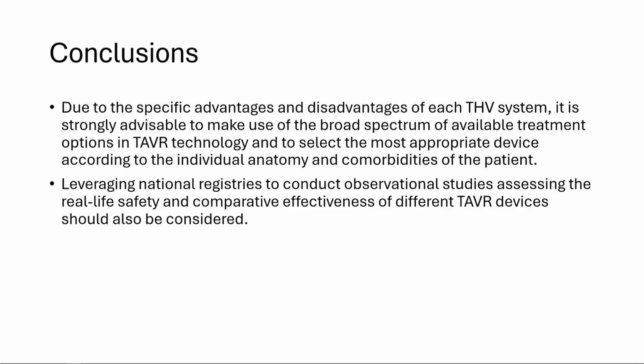So due to the specific advantages and disadvantages of each THV system, it is strongly advisable to make use of the broad spectrum of available treatment options in TAVR technology and to select the most appropriate device according to the anatomy and the comorbidities of the patient. Leveraging national registries to conduct observational studies assessing the real-life safety and comparative effectiveness of different TAVR devices should also be considered.